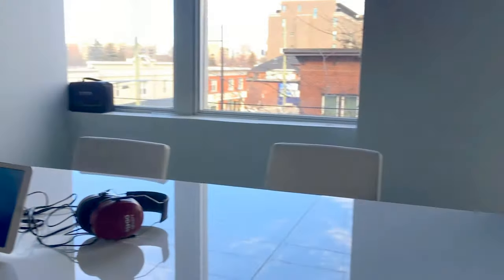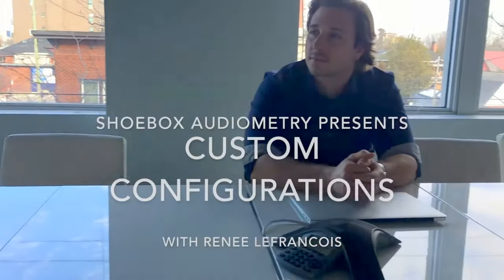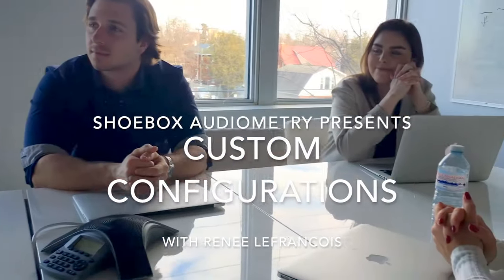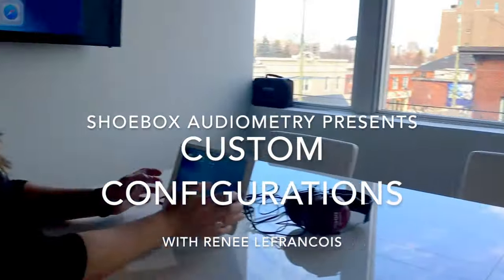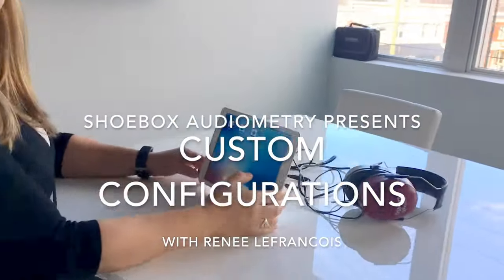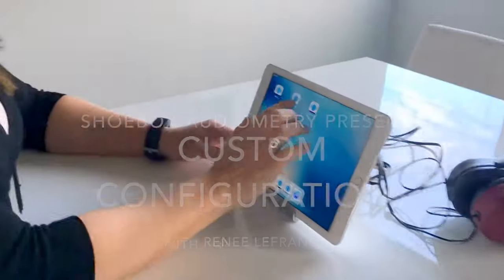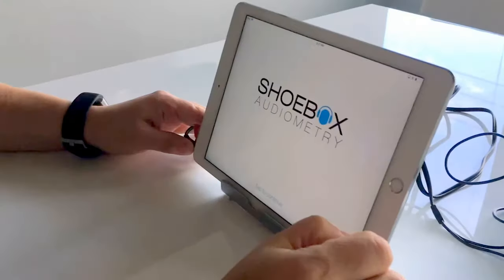Thanks everyone. Today we are going to have a quick session on how to set custom configurations for different populations. Alright, so we're actually going to work with Shoebox Standard today.